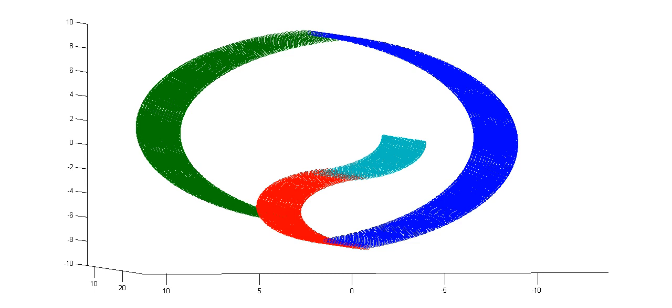So you would perform linear regression between the color of the screen, which is white or black at any given time, and every voxel in the brain. And you would see that not all brain regions are correlated with the flickering of that screen, but brain regions that are involved in vision are correlated with that, and maybe some other ones as well, because it's such a salient phenomenon.